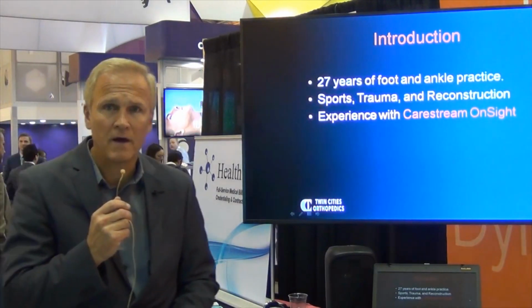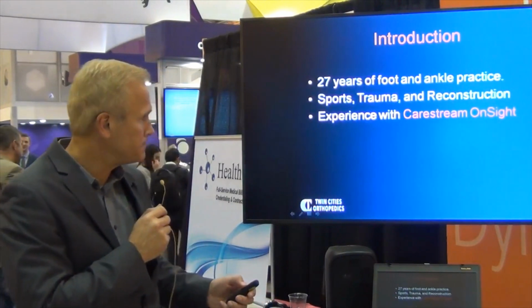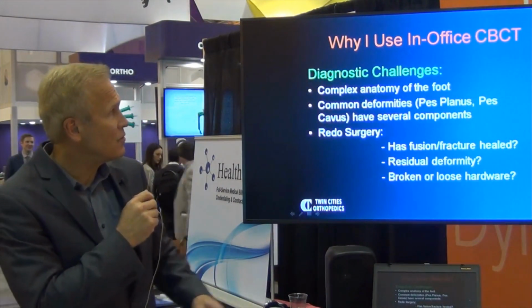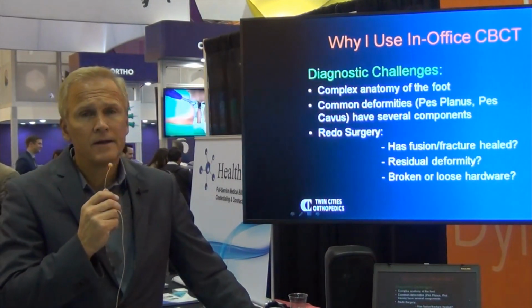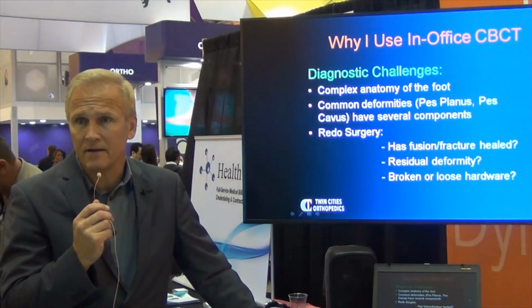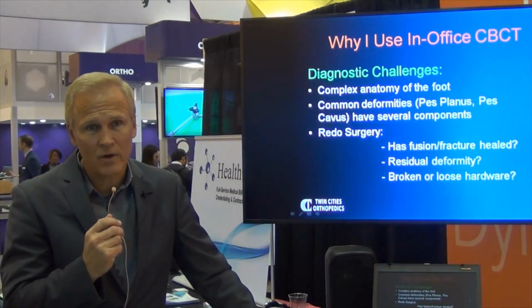So it's been a wonderful technology for me, and I'm going to share a little bit about why it has, to a certain degree, changed the way I treat my patients and evaluate my patients in the office and also post-operatively. So why do I use an in-office cone beam CT scanner? As I said, I didn't really use this until just recently. It was a technology that I knew was out there, but a CT scanner in the office was actually quite expensive. It's really changed what I do. It's changed the way I see patients.